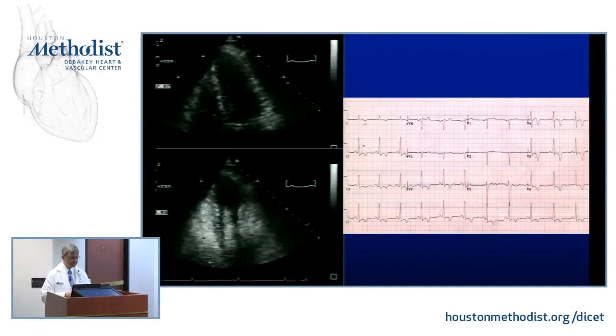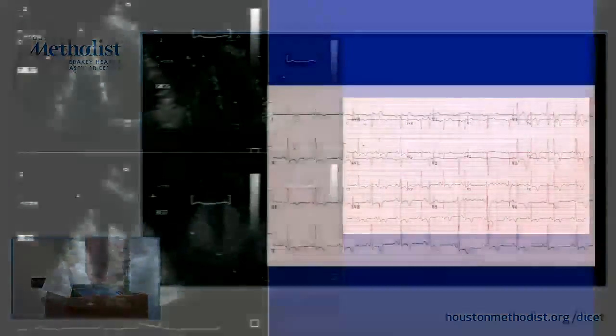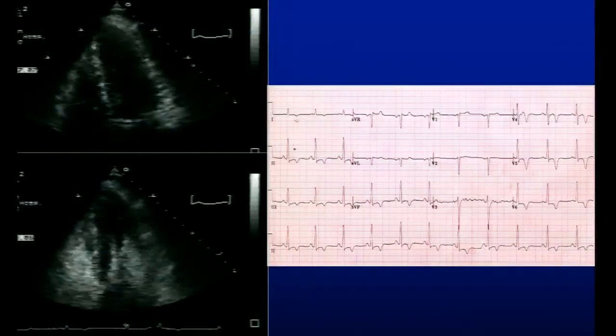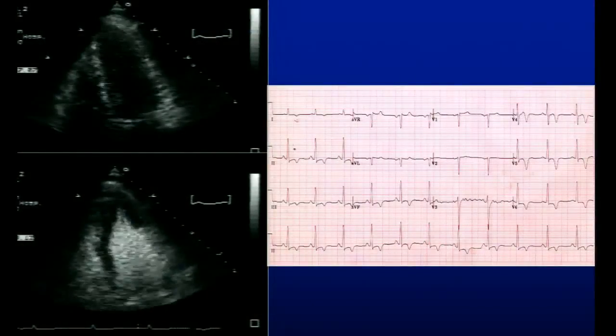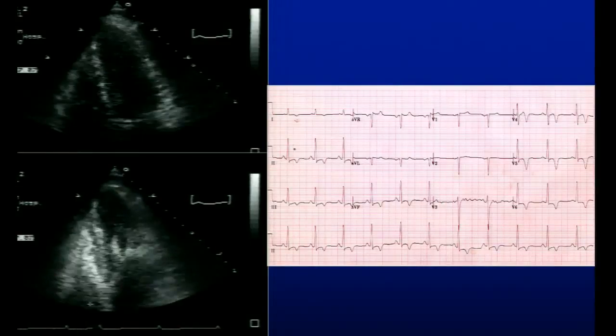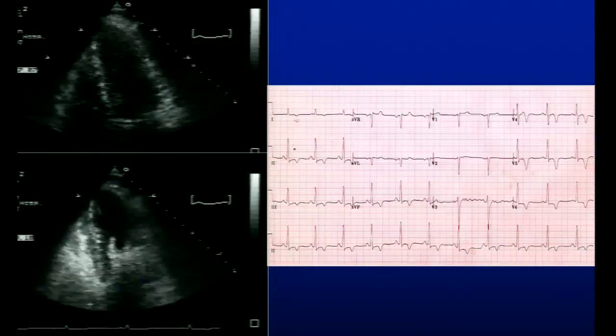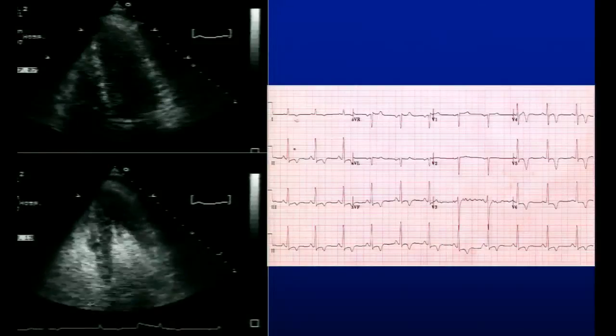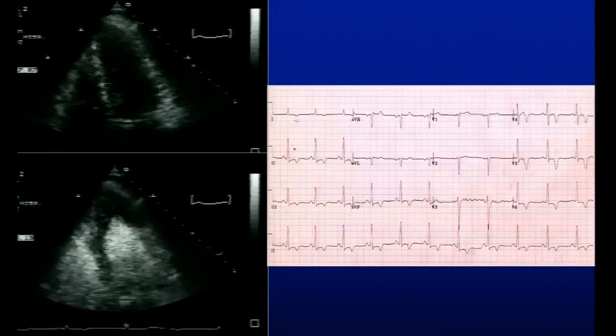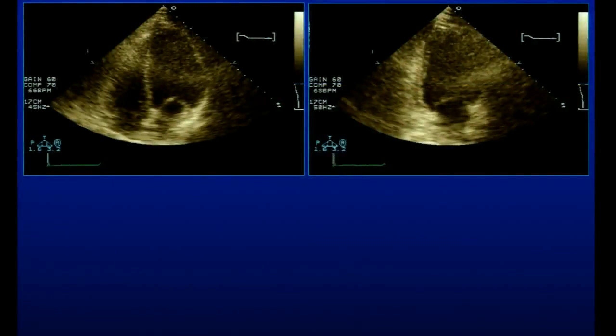Take a look at that. This is your garden variety, right? Apical hypertrophic cardiomyopathy with a spade-like apex. And yes, it can give you this, but you cannot differentiate it from ischemia early on, right? Somebody comes in like this. So it changes your diagnosis completely. Completely.